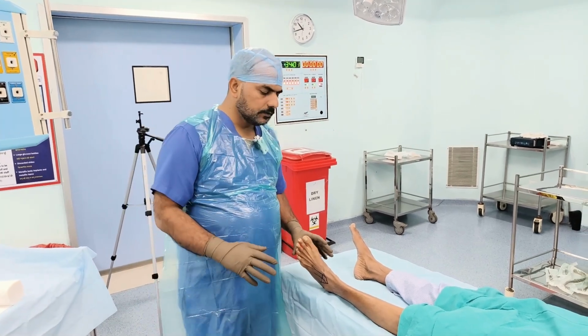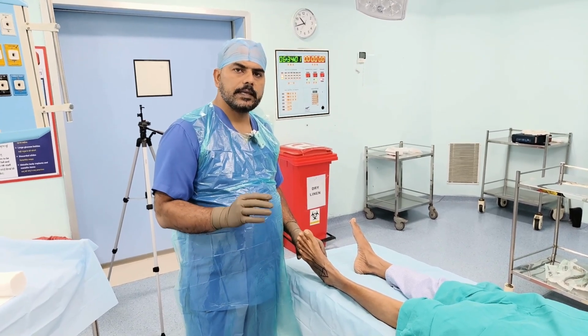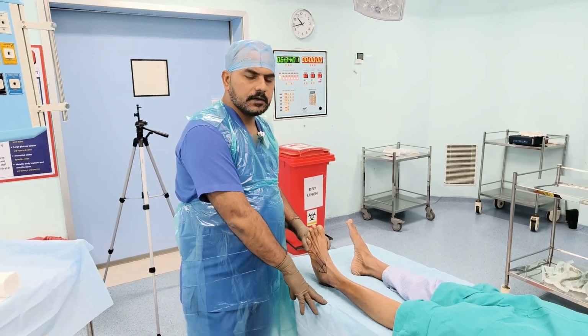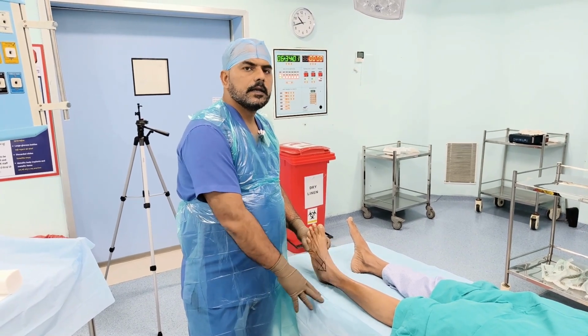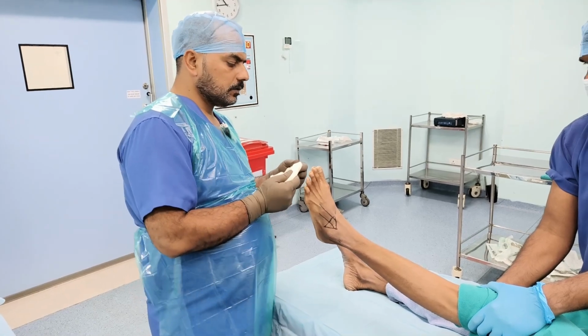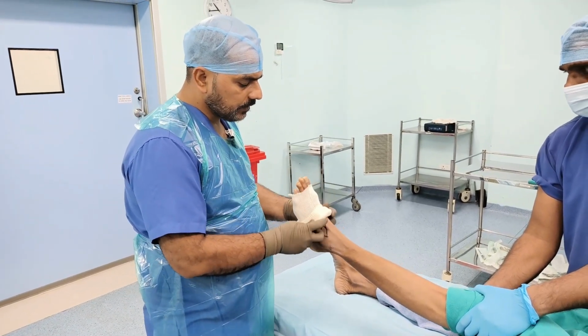I would like to give an important tip: whenever you are applying plaster to any patient, use a plastic sheet, which is easily available, and it will protect the linen from soiling and keep things very tidy.